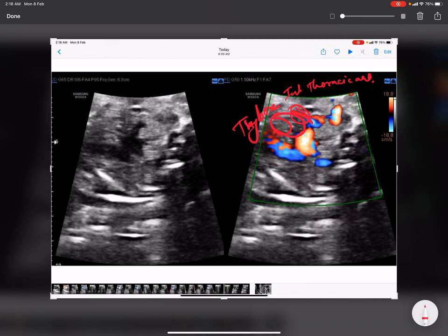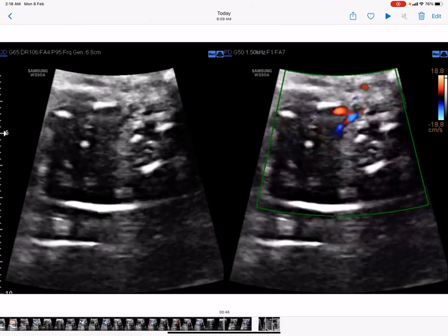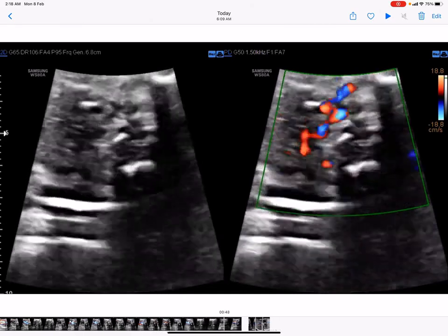This is the internal thoracic artery. This thing is the internal thoracic artery. This is a branch of right subclavian artery. So this is how we trace the right subclavian artery. Okay, friends.